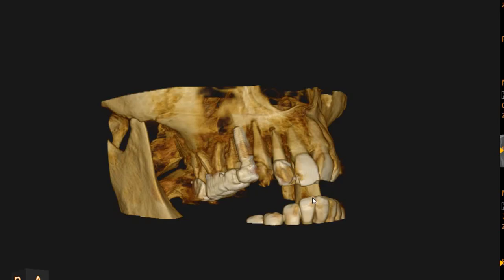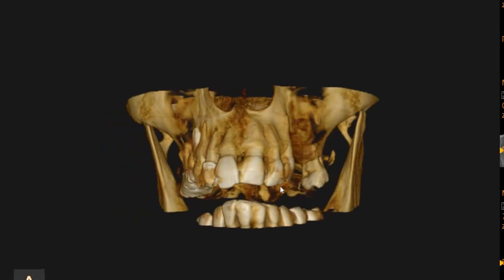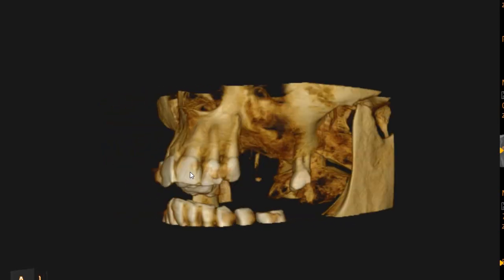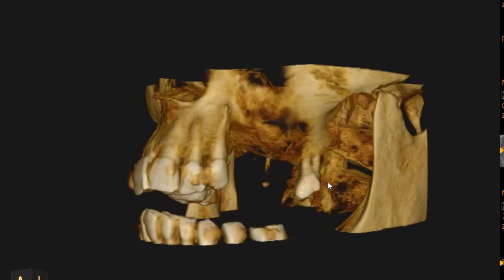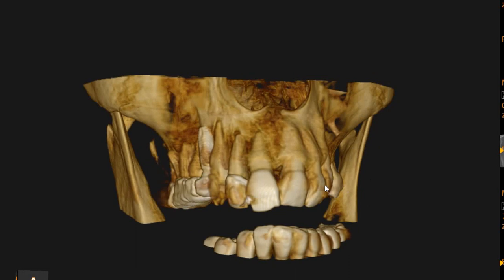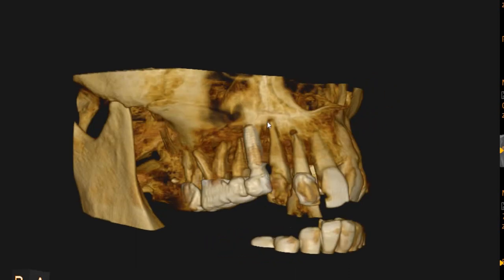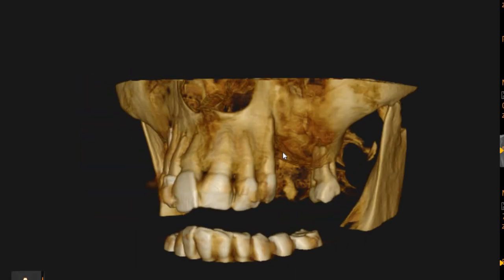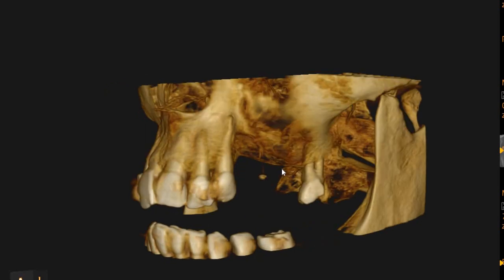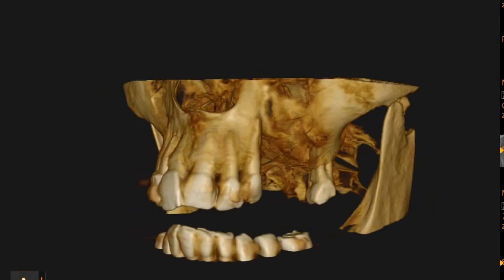Hello and Assalamu alaykum. Ultrascan Diagnostics here. This is the CBCT upper arch of the patient that you had requested. The area of interest is the upper right canine and the upper left first premolar region.